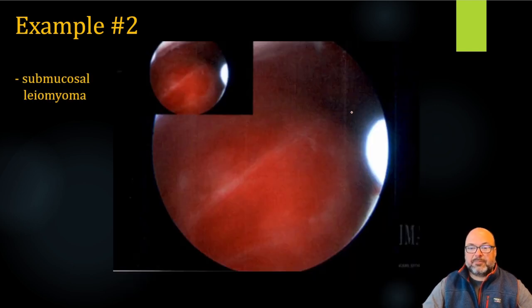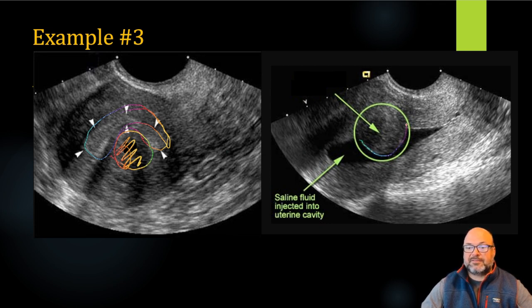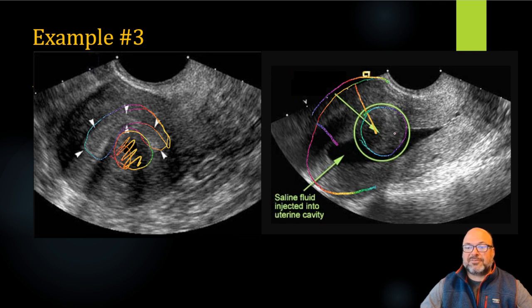So here we've got the main part of the endometrial cavity with this projection and fullness. We can see this is kind of normal appearing endometrium, but we definitely have some distortion of the cavity with this mass here. Throw a little bit of fluid in there — look at how clear that is. It's so easy to see that this is a submucosal fibroid. This would be right about that 50% penetration, so this would be a nice fairly straightforward resection to shave this down, but you're going to have a little bit of a thin spot there.